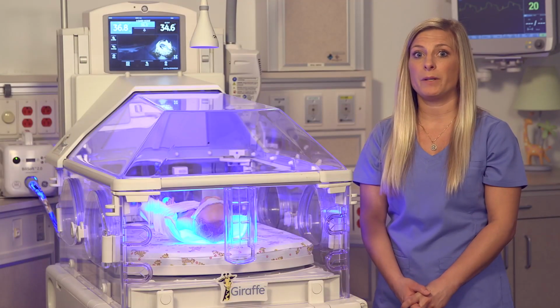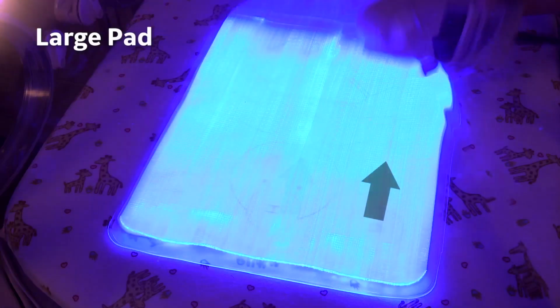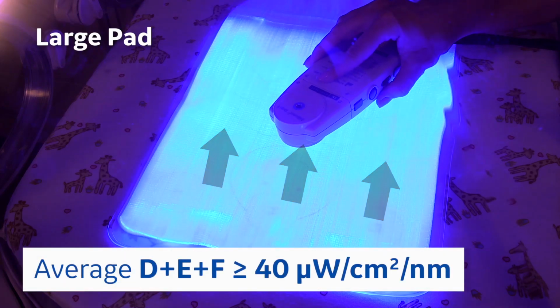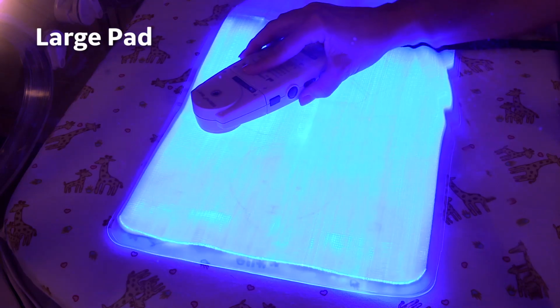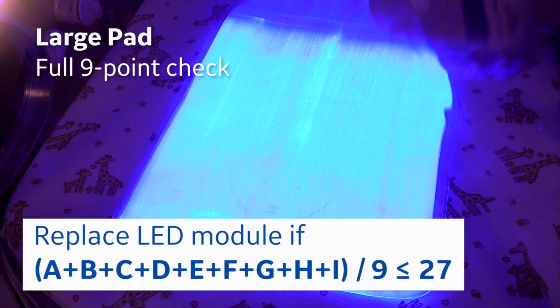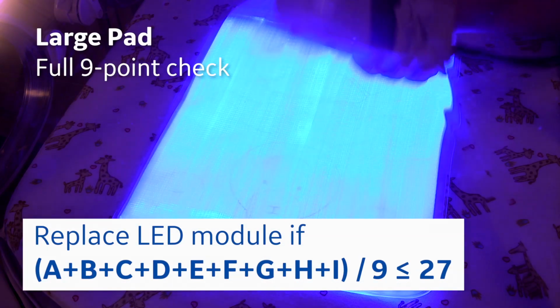If you have the large BiliSoft 2.0 pad, to do the quick reading, check the center row, D, E, and F, and take the average of it. If it is greater than or equal to 40, then it's okay to use. If it's less than 40, then do the full 9-point check. If the 9-point check's result is less than or equal to 27, then it is time to replace the LED.